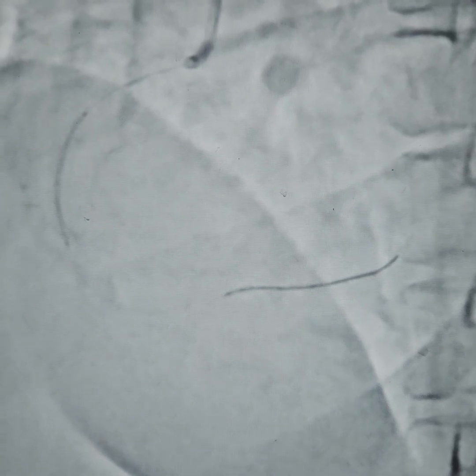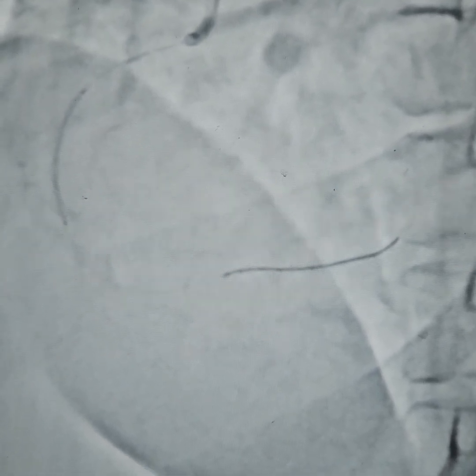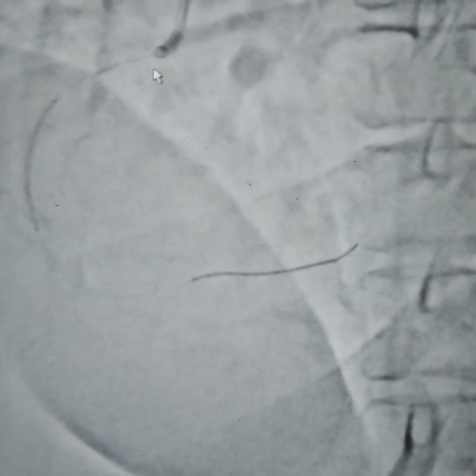And the importance of a clean procedure, using good technique where you're not working against resistance, is very important, because we want to preserve the radial artery as much as possible so that future interventions can also be done, like in this case in this patient. So yeah, you can see the right radial artery.